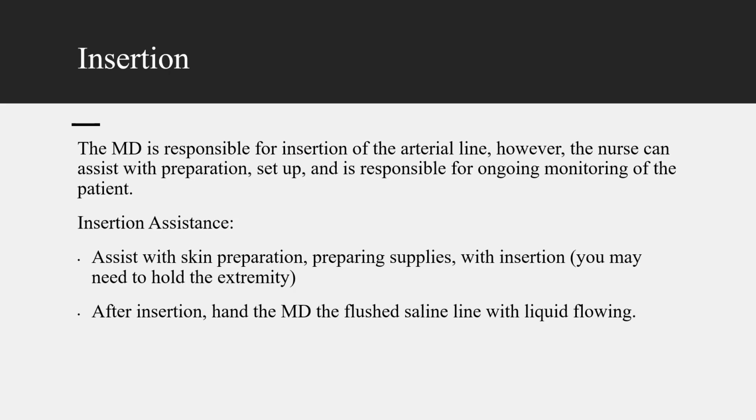All right, so ultimately the doc is responsible for insertion of the arterial line. However, the nurse can help with preparation and setup. You might be asked to hold an extremity while the doc is inserting, and then certainly it's the nurse's responsibility for ongoing monitoring after it's been inserted.